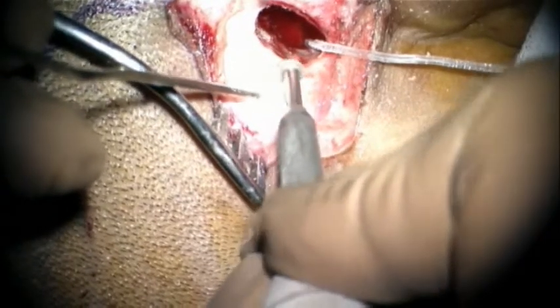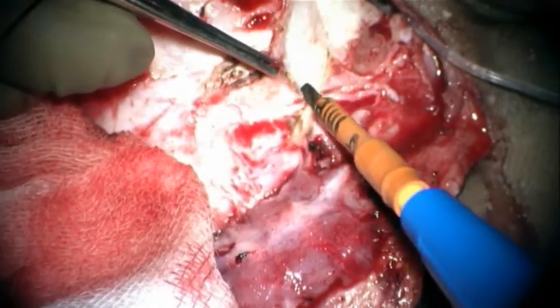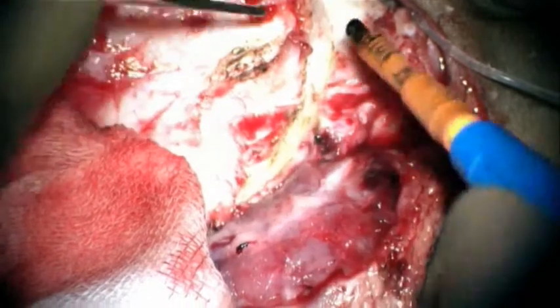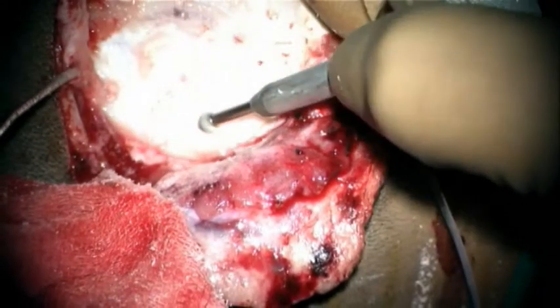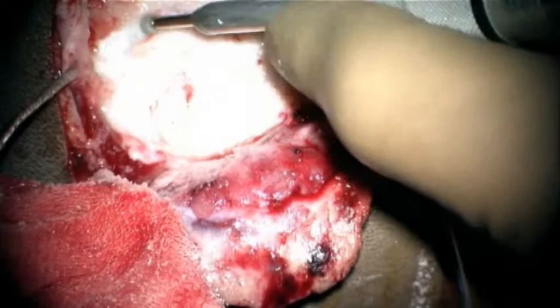A groove is created to allow the cochlear implant to sit in it, and the temporalis muscle is elevated to allow us to insert the cochlear implant below it. A bed is created to place the device, with the bone drilled out carefully so as not to damage the dura below.